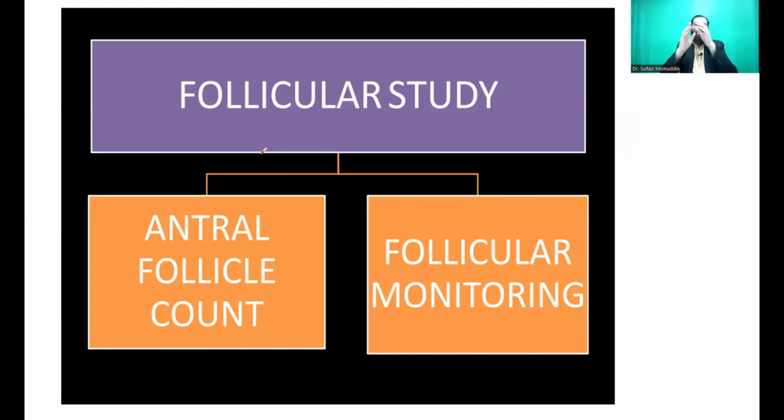Okay, now I'll show you a few slides dedicated to follicular study. So when you do follicular study, especially in case of PCOS, just now we had discussed PCOS. So it's better to discuss follicular study together. Right? This is called linking topics. Okay. Whenever you study something or learn something in life, you have to link it. When you read anatomy, link it to clinical life. If you do radiology, link it to anatomy like that. So this is how you will remember the subject well, and your fundamentals of the subject, your diagnosis will become very good. Now, coming to follicular study.